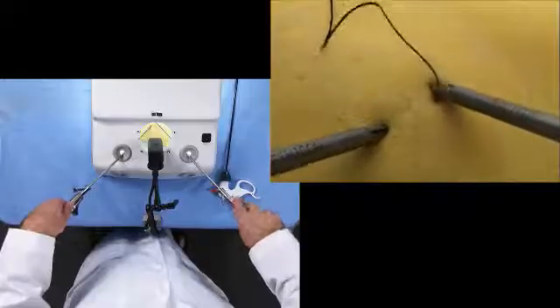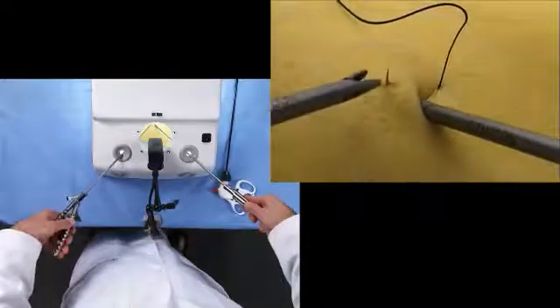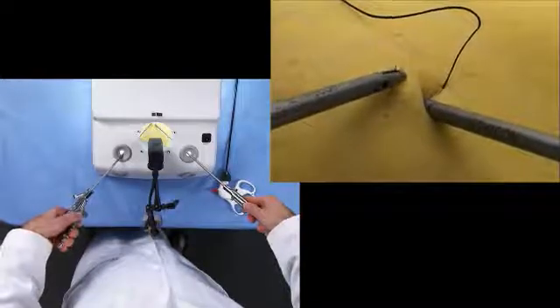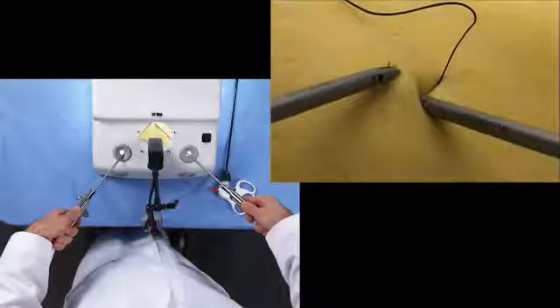penetrate through the tissue by extending, abducting, and rotating. We then grasp the tip of the needle with the left hand and lock the left hand.